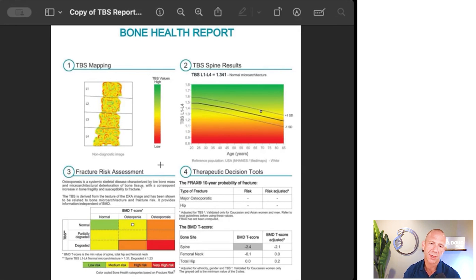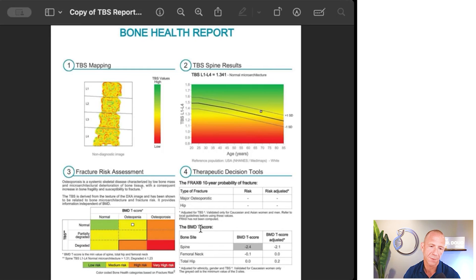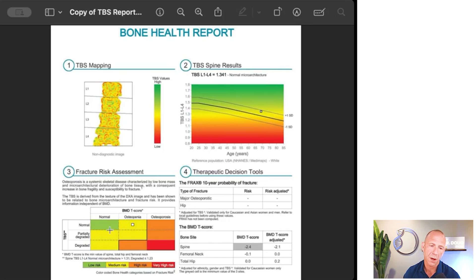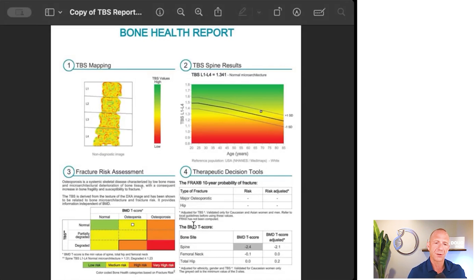TBS uses the X-ray to assess the architecture of the bone. In the bottom left of the report, there's a three-by-three grid: TBS score on the left axis, T-score classification — normal, osteopenia, osteoporosis — on the horizontal axis. So you can have a normal T-score with partially degraded bone, or a normal T-score with degraded bone, and similarly osteopenia or osteoporosis combined with various TBS levels — all the combinations appear in this grid.